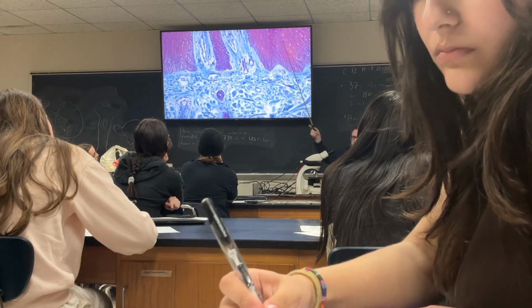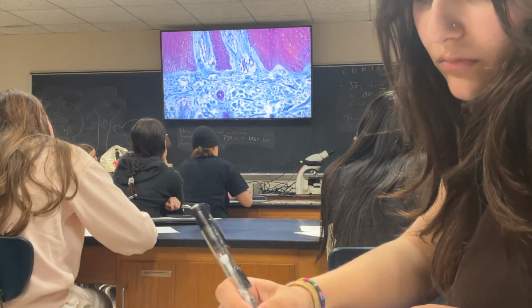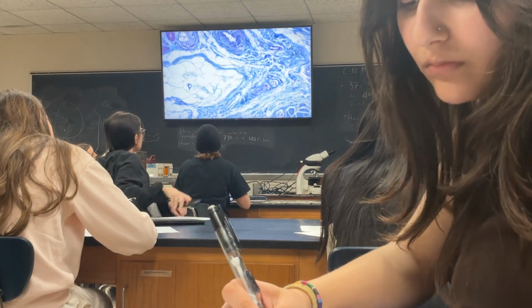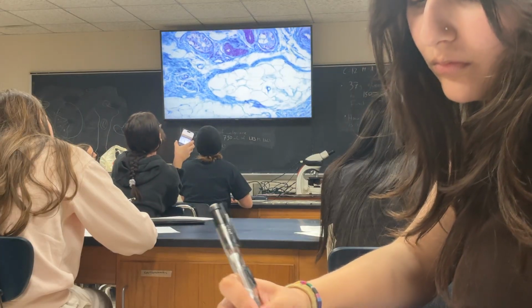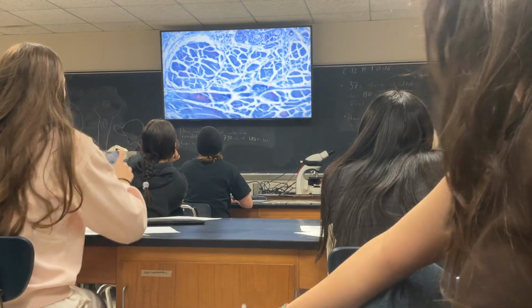You don't have to do it that quick, obviously. But that's where you want to be close to when you go to practical. And then I scroll down and I see what? Out of those, what do you think this is?